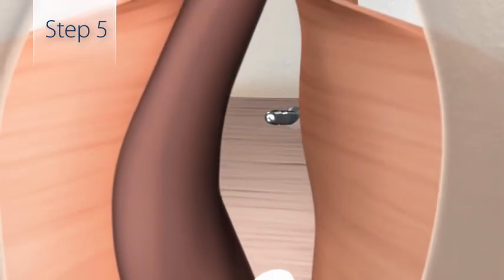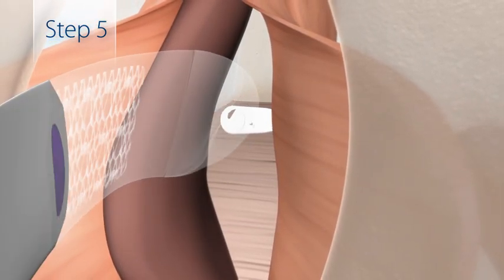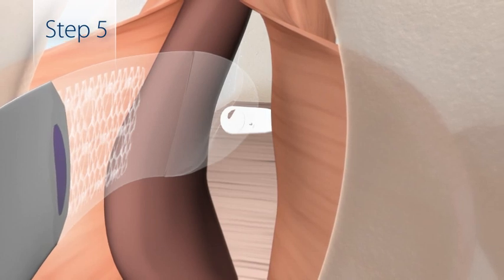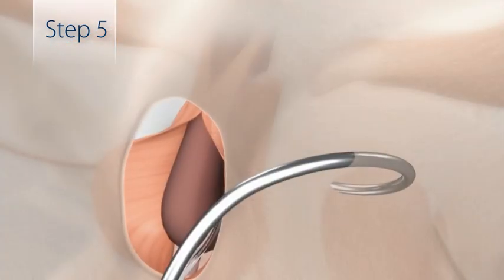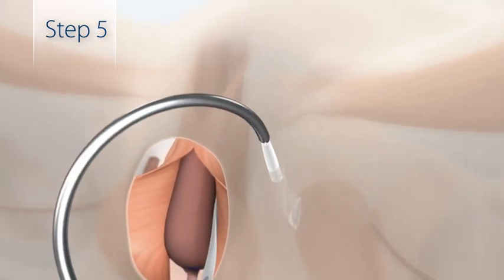After passing the needle, connect the sling by pressing the white connector onto the needle tip until it clicks into place. Make sure the blue dot is facing away from the urethra. Once connected, draw the sling out the stab incision by rotating the needle back along the insertion pathway.